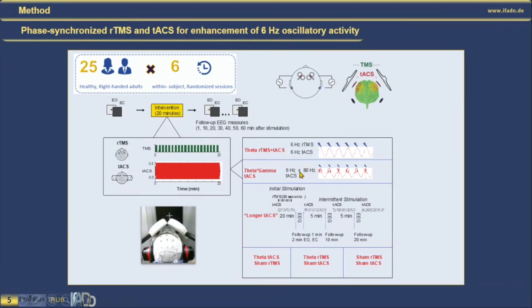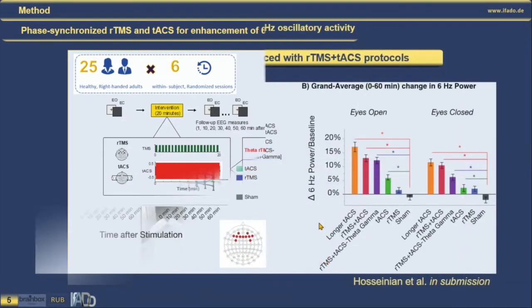And it's a cross-frequency tACS, which has been demonstrated to be involved in working memory. And also for another protocol, we wanted to see whether after effects could be sustained longer by intermittently continuing tACS every 5 minutes after the main block of the stimulation. So let me quickly go to the results.